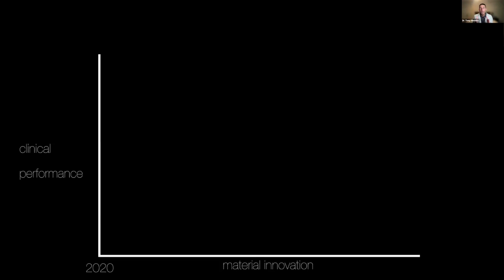So what I'll talk about in this slide is the fact that innovation in this area is moving very, very rapidly as far as printed resins go, versus our CAD/CAM materials, which really haven't had much in the way of innovation over the last 10 to 15 years. Zirconia and the process of milling and sintering zirconia has had some innovation, but for the most part, the materials are the same as they've been for the last probably 10 or 15 years. So there's not a whole lot of innovation on the CAD/CAM material side, but the clinical performance of those materials is fantastic. And I'll talk a little bit more about that later.